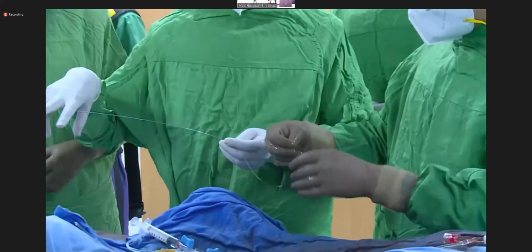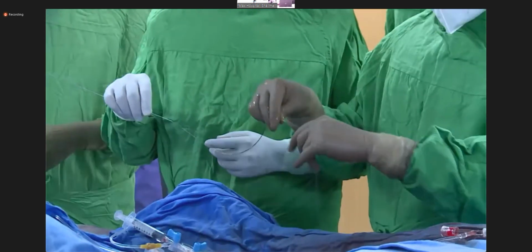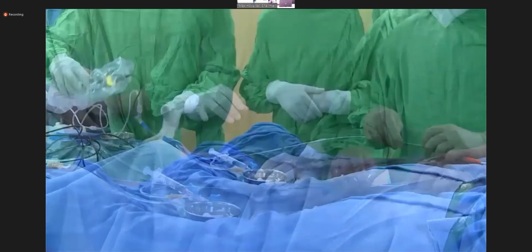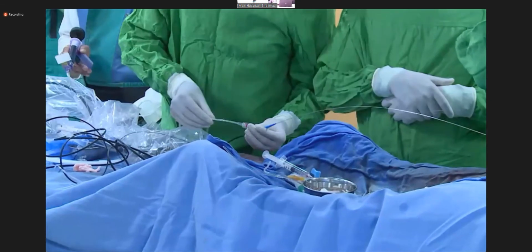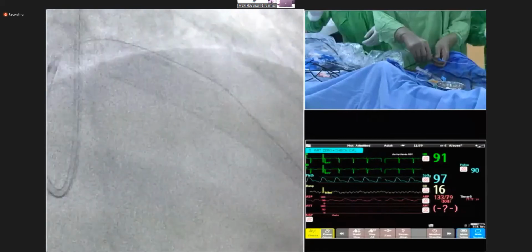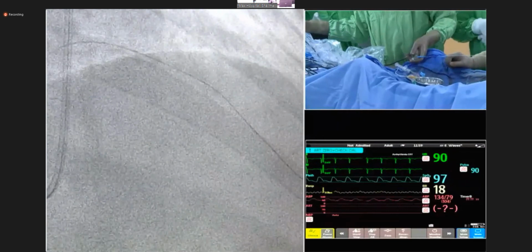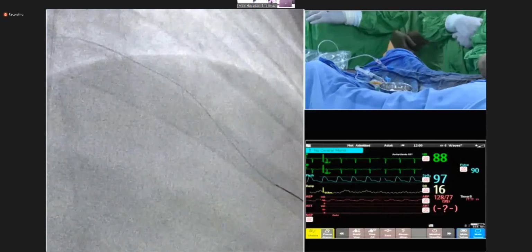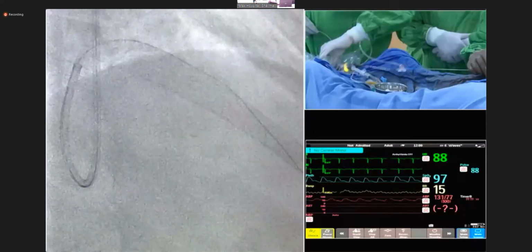So now we are going inside with the IVL 3 into 12 millimeter balloon. Let's hope for the best that this will cross easily. Holding the wire? Yeah, holding the wire. So the strategy will be, we'll come from distal to proximal. This is a little bit bulkier balloon, but once we cross it, we are going to achieve the results we are looking for. Just show me the guide, please. Guide tip. And we're taking this IVL 3 into 12.